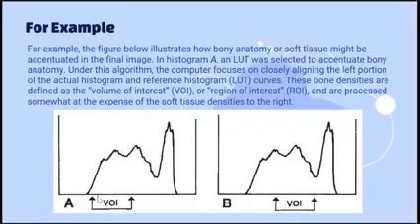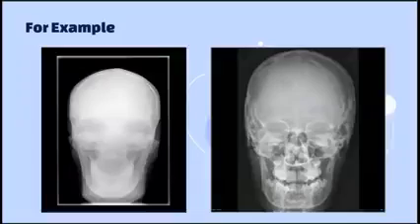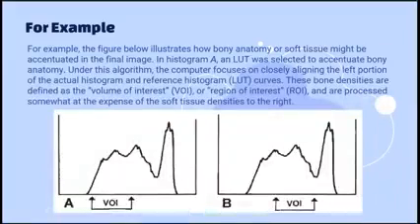So if your volume of interest for this lookup table is in this area, which means your image will produce or accentuate, no, bony na mga anatomy, because again, dito man siya na area. And in this area, mga bones man ang primarily in this area. Okay, so your image will result like this one on this area here. So as you can see, the bony anatomy is accentuated. Okay, it's parang, what's that word?